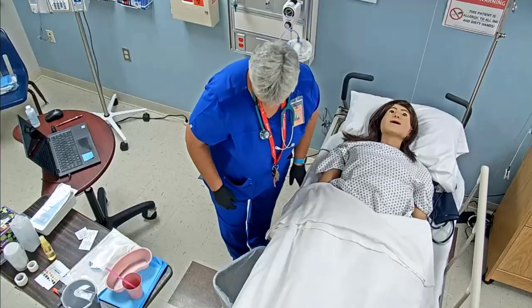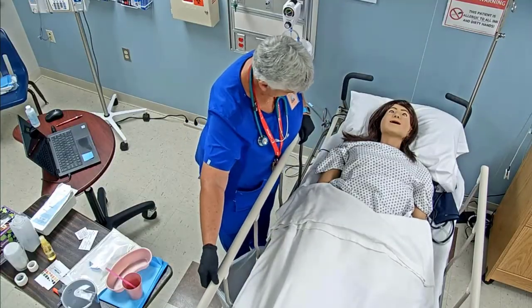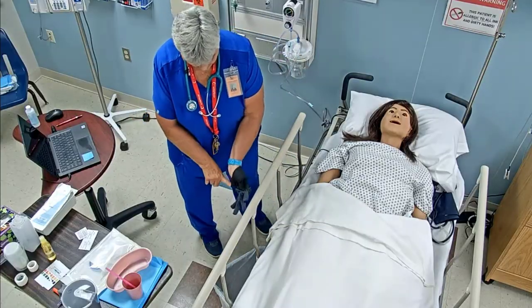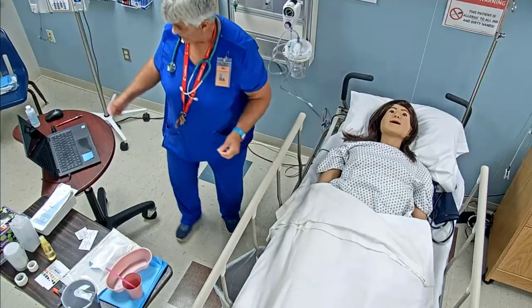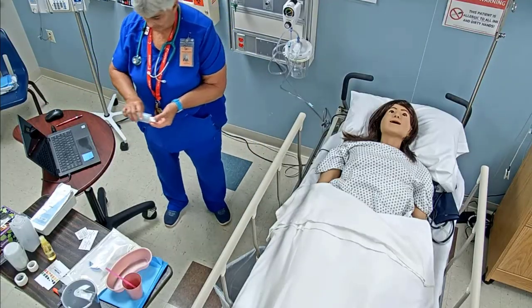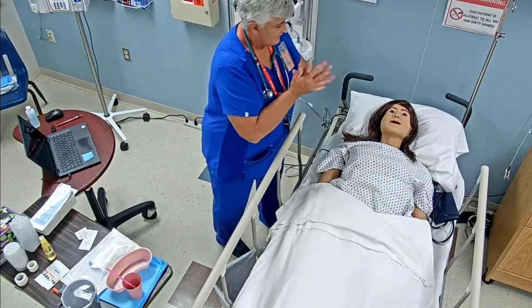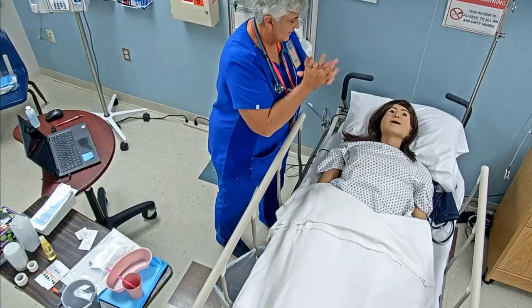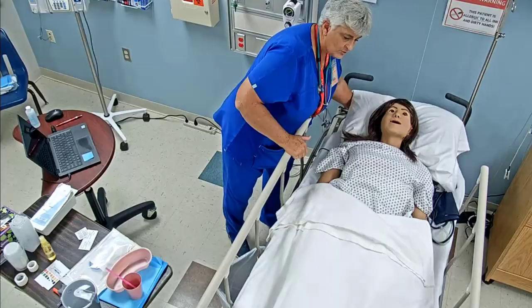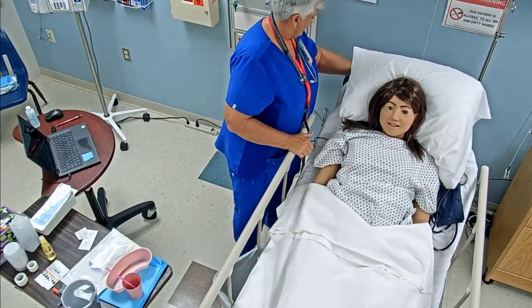And I'm going to put this side rail back up while I get everything ready. I'm going to go ahead and take these gloves off, glove to glove, skin to skin, and go to the wall and do my medical hand wash. And then we're going to put you into a high Fowler's position. I didn't see anything in your chart that indicated you couldn't sit in a high Fowler's.